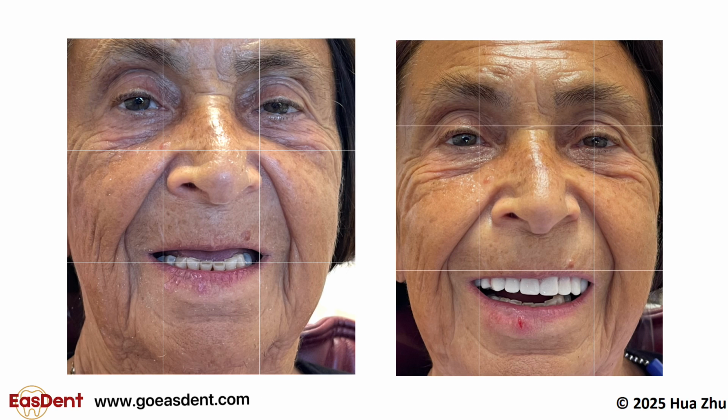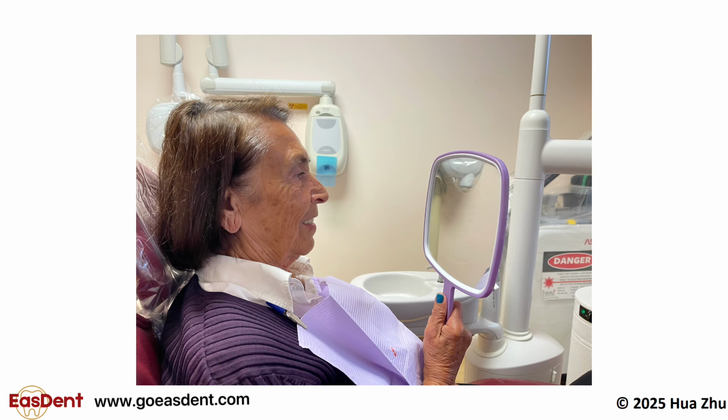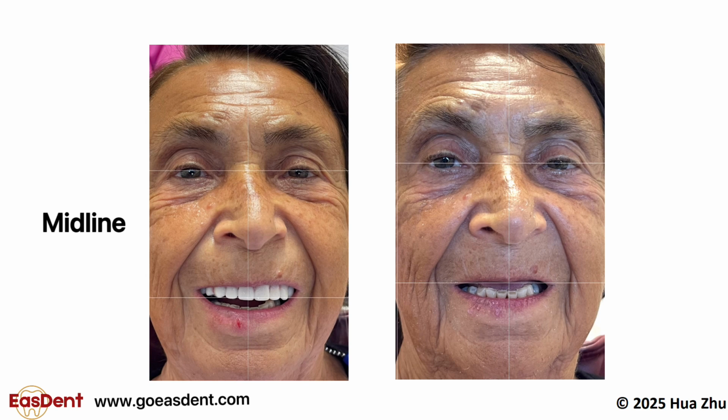Evaluating the aesthetics of both the Easdent teeth and the opposing teeth is very important. Provide the patient with a mirror and involve them in the aesthetic evaluation process. Ask the patient to relax and to smile. Identify the facial midline, then evaluate the midline of the teeth on both the Easdent tray and the opposing arch. Determine which midline is more accurate or aesthetically pleasing. Choose one as your reference midline and give the lab clear instructions on the correct midline relative to the reference midline.